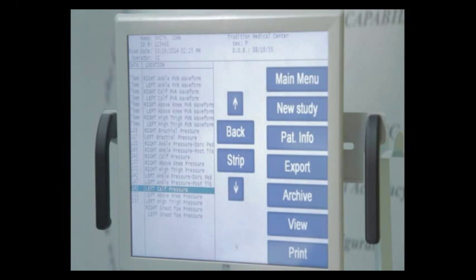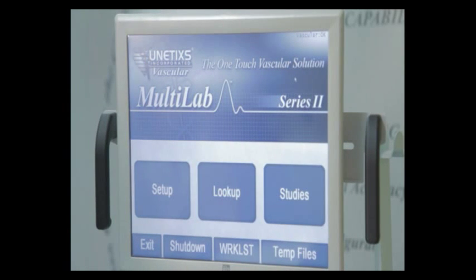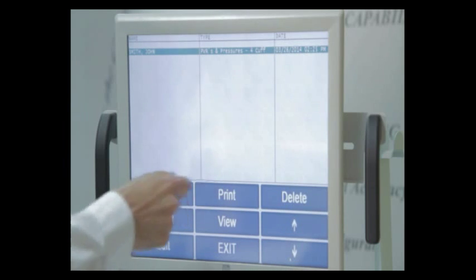One thing I need to make you aware of, if you want to send your patient study to your PACS system, it must be done from the temp file. Remember, everything stays in your temp file until you archive it or delete it. So at any time that it's in there, I can go back to it, I can export it, I can archive it, I can print it.